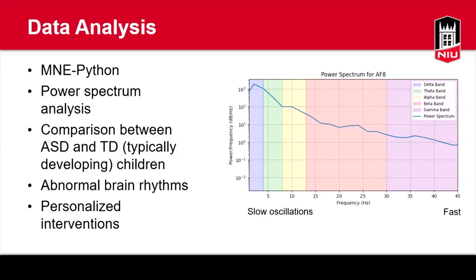Another version is, as you mentioned, we can see the timeline. There is a scroll bar, so we move this and in real time we can see it over time. So we are considering both levels of interpreting data. Dr. Cho is working on some machine learning. What are the important contributors that distinguish between neurotypical and autistic children? That way we can also identify the important measures. We are still working on that right now.